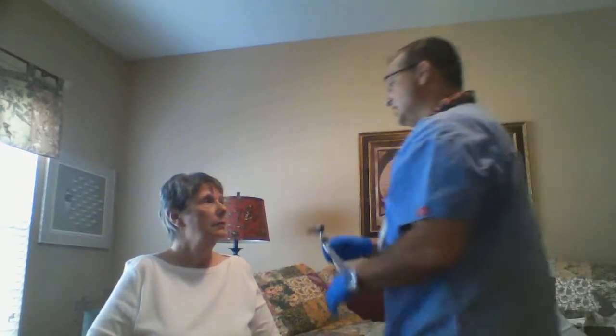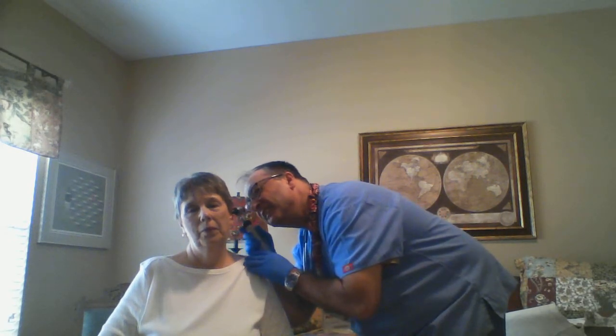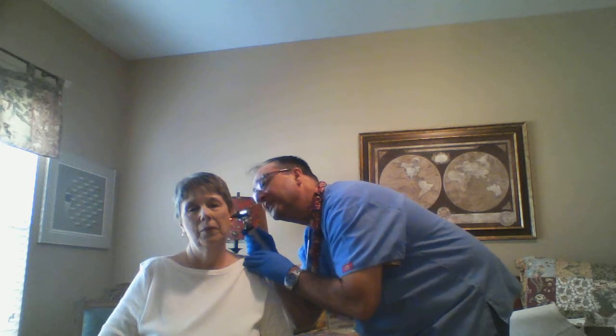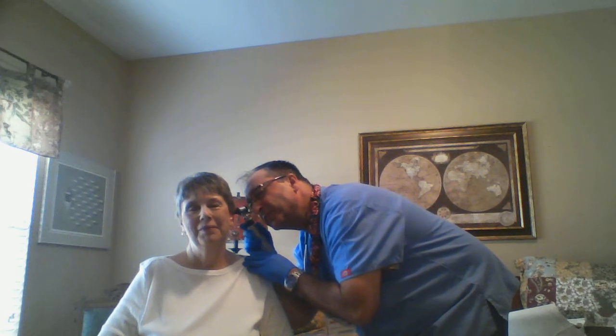And now I'm going to check your ears. So the first thing I'm going to do is pull up on your ear. Any pain with that? No. Okay. So I'm going to visualize the light reflex and the ear canal and see everything looks nice and clean, a pale yellow. No drainage or anything noted in there. All right, same thing over here. Any pain when I pull? No. Okay. And everything looks good and clear in there.